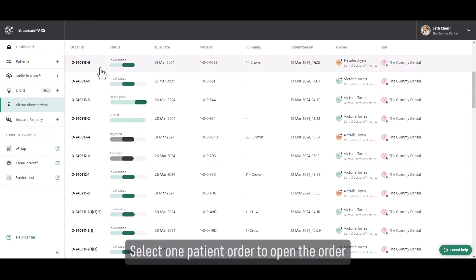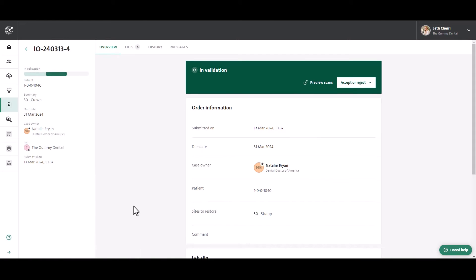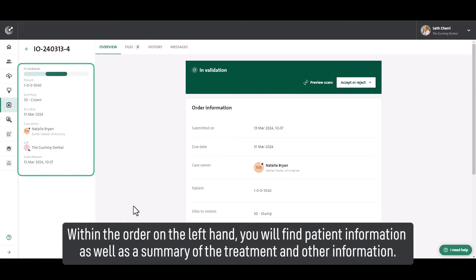Select one patient order to open the order. Within the order on the left-hand side, you will find patient information as well as a summary of the treatment and other information.